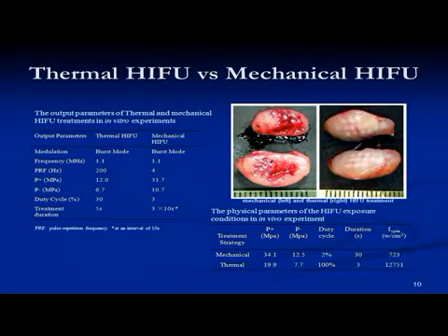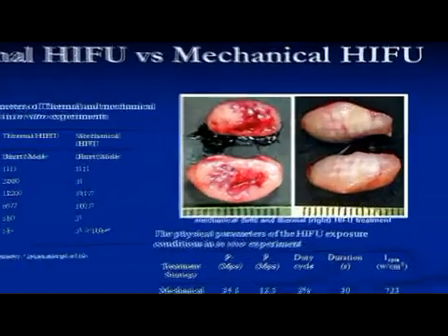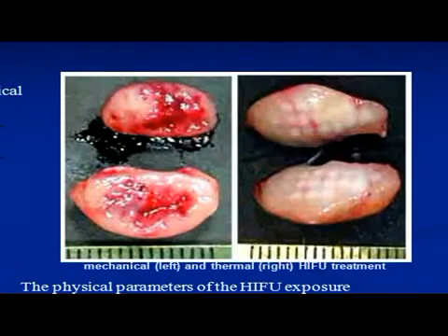Ultrasound is a sort of mechanical wave which vibrates millions of times every second, but HIFU just uses its heat effect. The left chart shows a mechanical effect which causes bleeding, and the right chart shows a heat effect which is the reason for tissue coagulation. Our expectation is the result of the right chart.